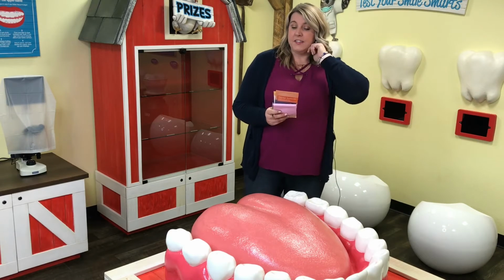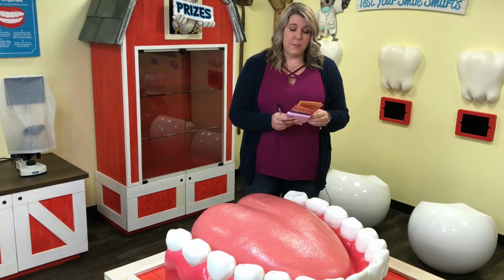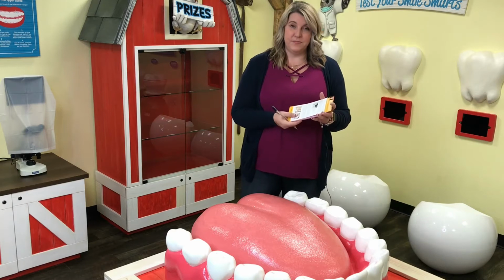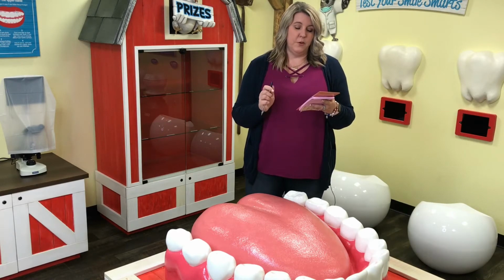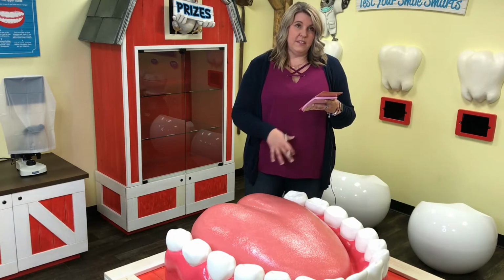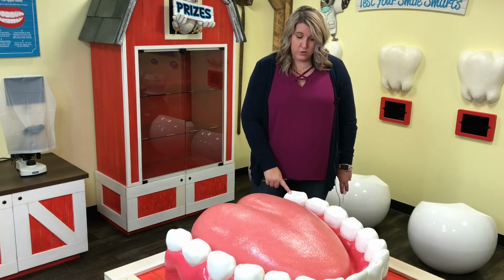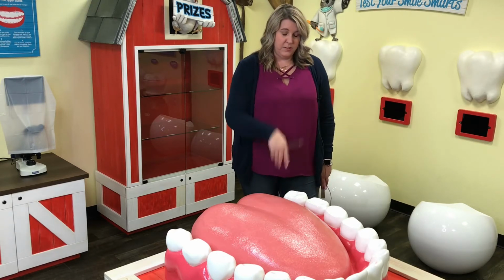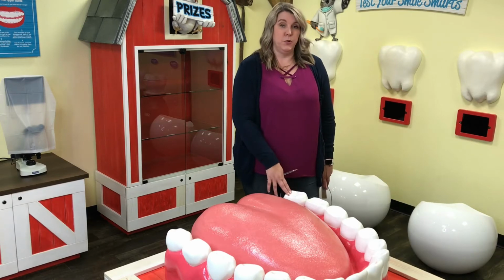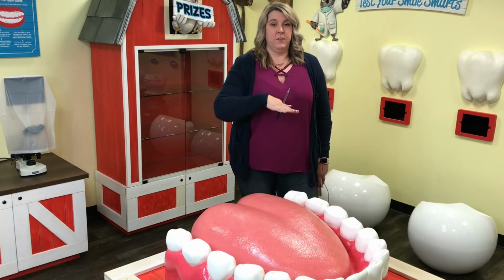Okay, so today we're going to cover sealants, again, why we do them, what ages, and the application process. So first thing I'm going to do is read directly from the American Dental Association on what an actual sealant is, okay? A sealant is a material applied to the chewing surfaces of your back teeth. It is a protective coating that, once it's there, doesn't allow food and plaque to get in. It's put into your molars only because of the grooves in your molars. They're only applied to the back teeth because your back molars, as you can hopefully see on this video, have lots of pits and grooves in them, whereas your front teeth are more straight on and don't have as much of a chewing surface, okay?